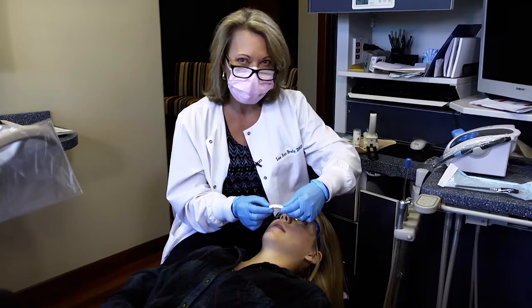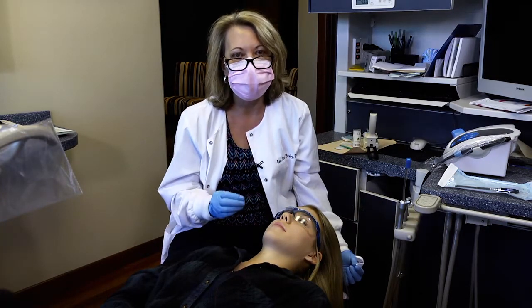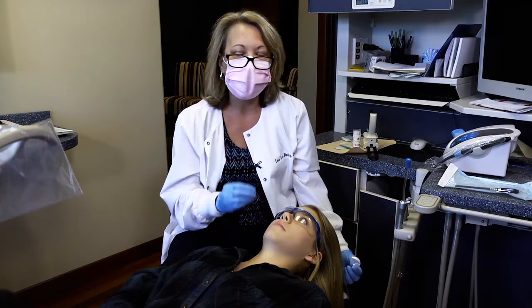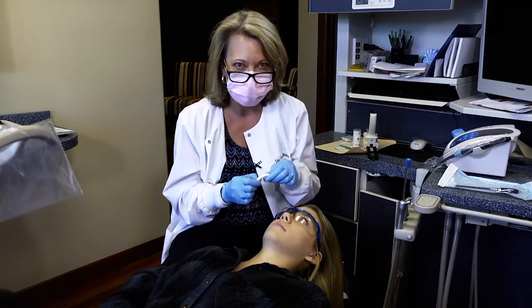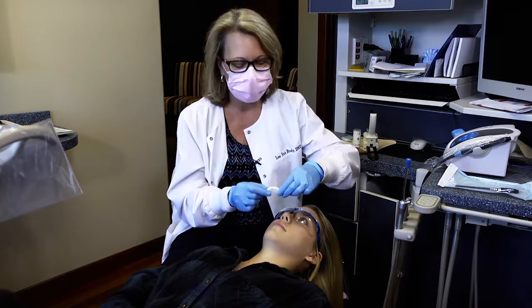I'm trying it in for two reasons. Number one, I want Jenna to get to experience having it in her mouth and then actually biting against it, so that when we do that already with the bite registration material in it, she's familiar with what I'm going to ask her to do. I'm also just visually getting a reference for positioning it over her teeth.